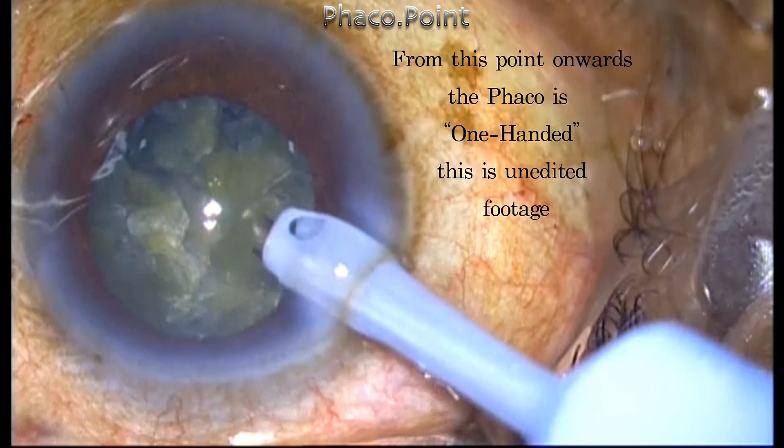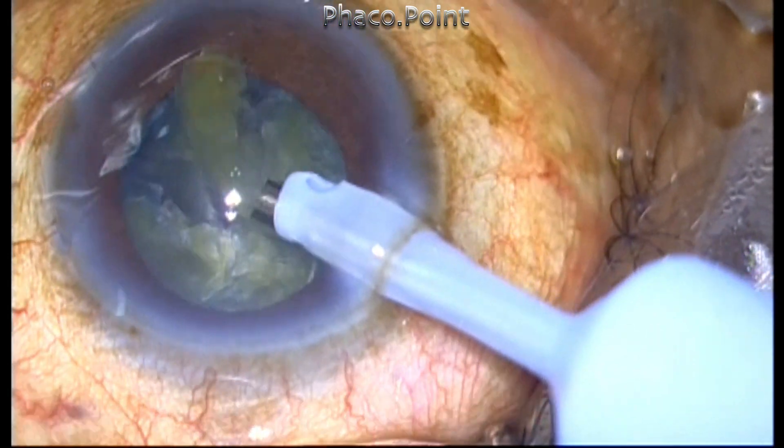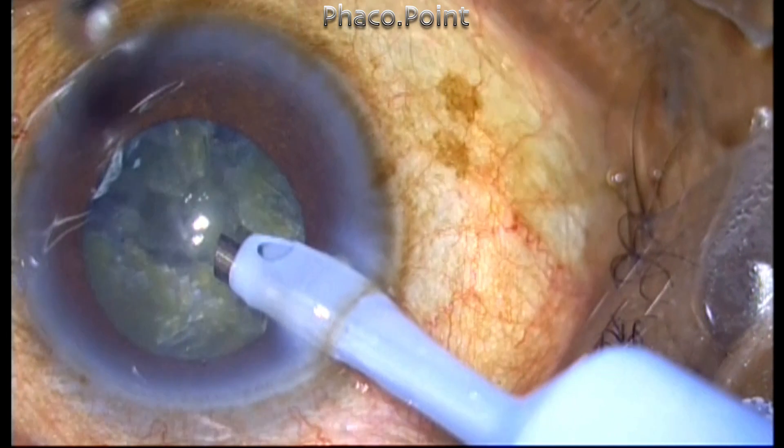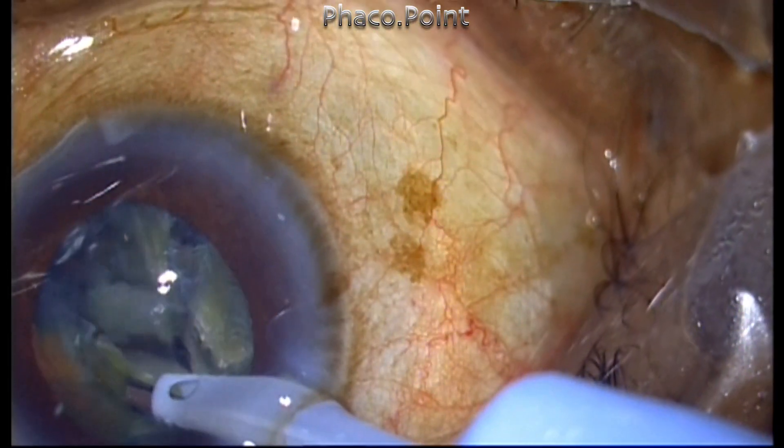At this point the FACO is one-handed — there's no sideport instrument at all — and what you're about to see is totally unedited. You can see that the flow as well as the vacuum can be used to attract the pieces towards the FACO tip.